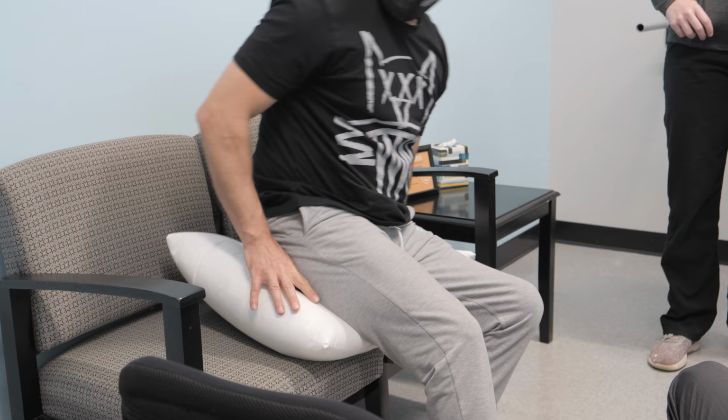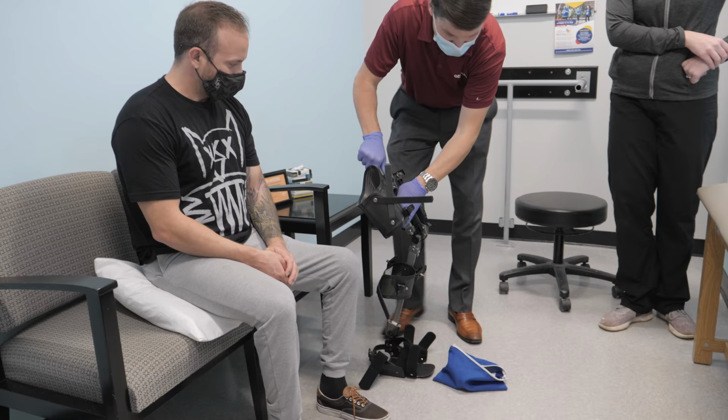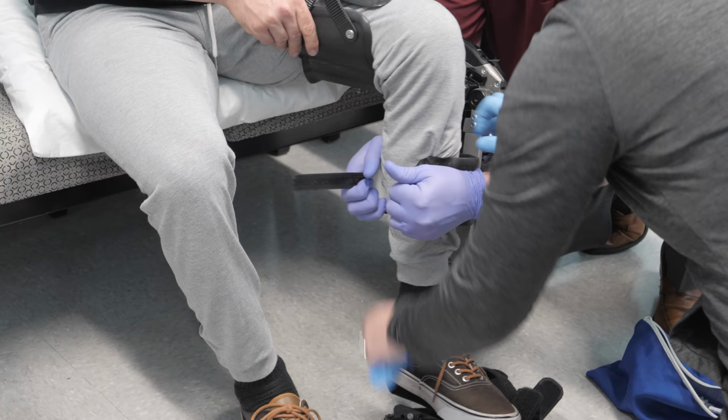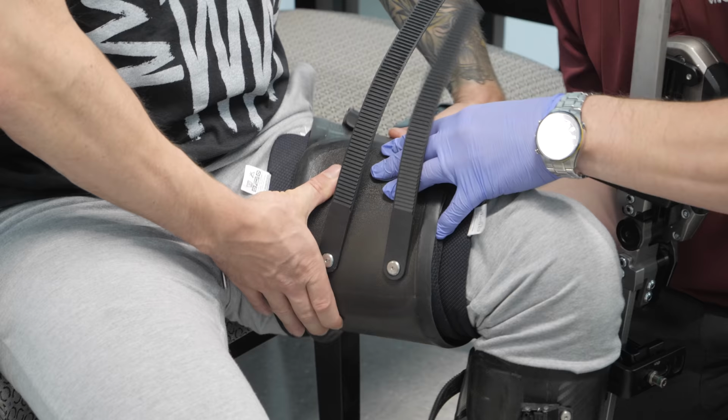Hey, yeah, it went right into my tailbone. Just kidding. So I think we've got this really plantar flexed right now. Yeah, I was going to say, it looks like this bar needs to slide back a little. How does that feel? Yeah, that's right. I am a little bit.